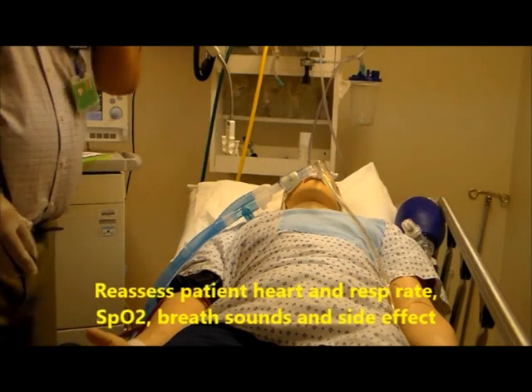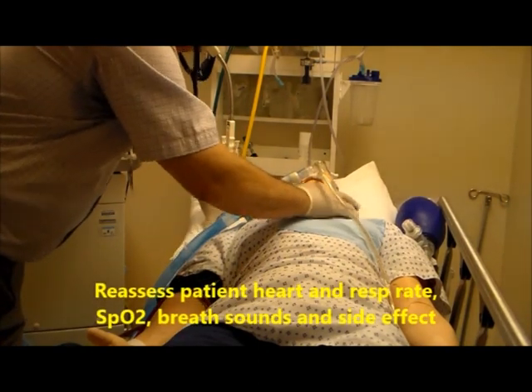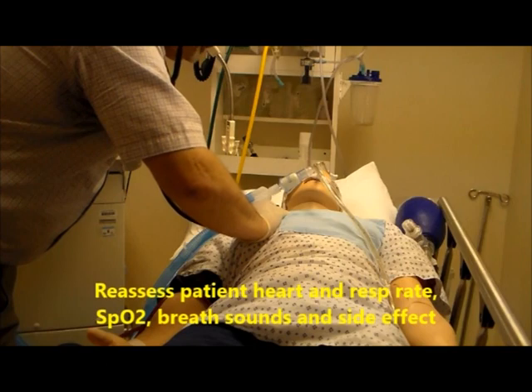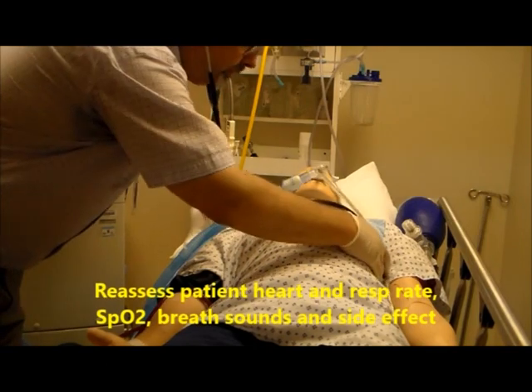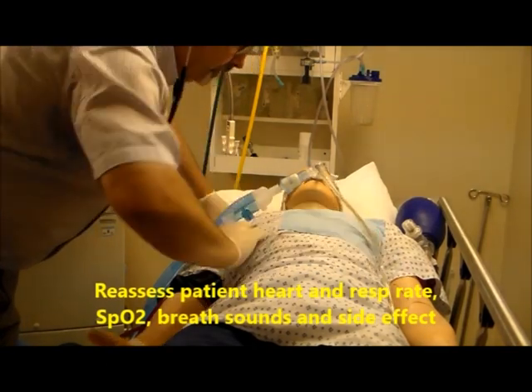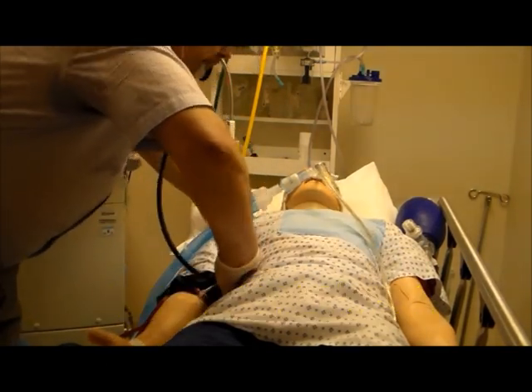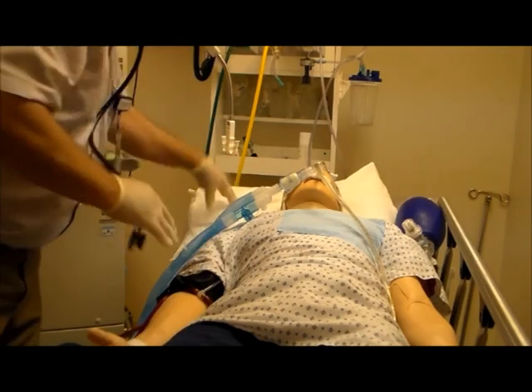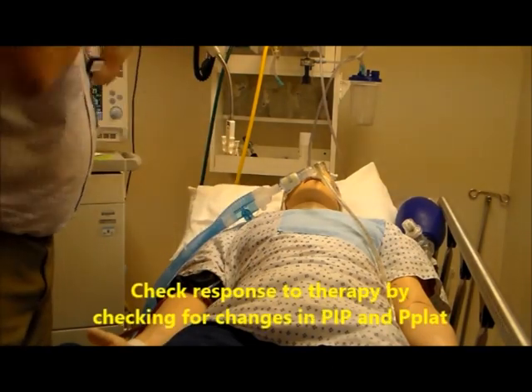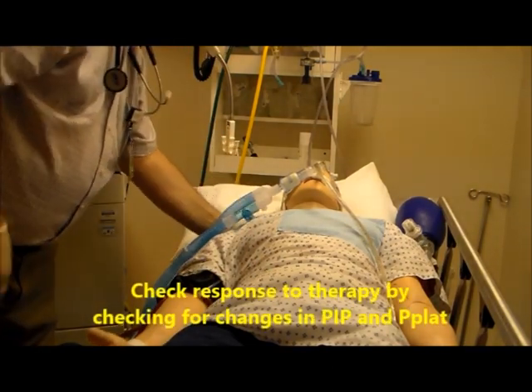After completion of the treatment, make sure you reassess heart rate, respiratory rate, SpO2, and breath sounds. You want to monitor for any adverse reactions, and also assess responsiveness by checking changes in PIP and plateau pressure.